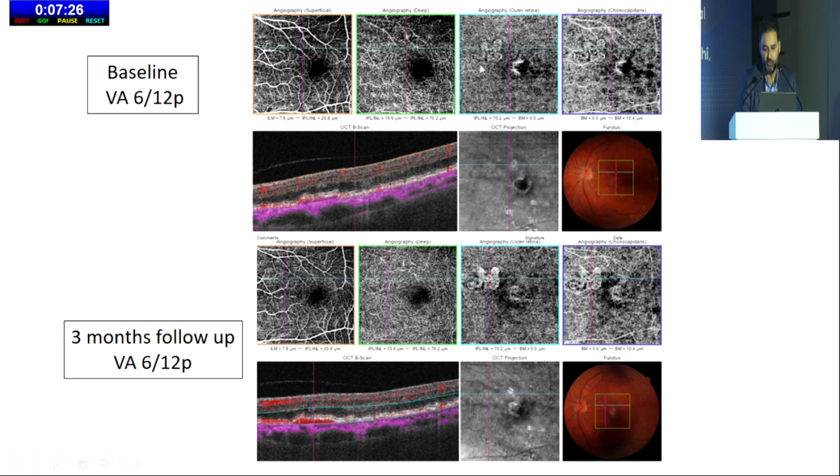No SHRM. However, on the OCTA, you can see that the butterfly kind of thing has actually become denser, as have maybe the vessels in that kind of sea which was surrounding the foveal avascular zone. So now it's clear that this is a case of non-exudative neovascular AMD. Fair enough. Patient's asymptomatic. We have 3 months follow-up. The patient's not saying anything, doesn't complain, but the membrane on OCTA has become denser. Whether it has grown in size, no, but there are definitely more vessels there.